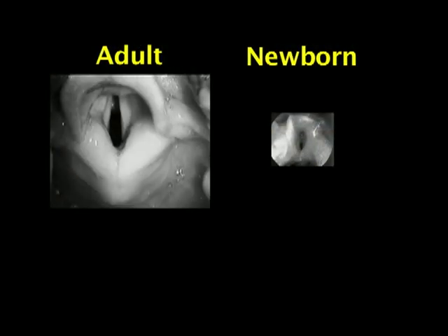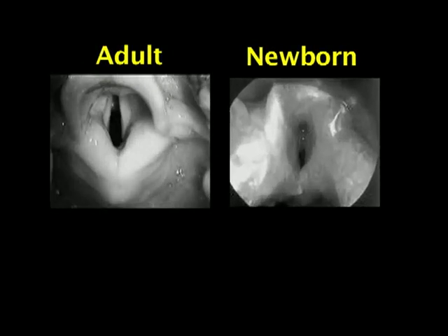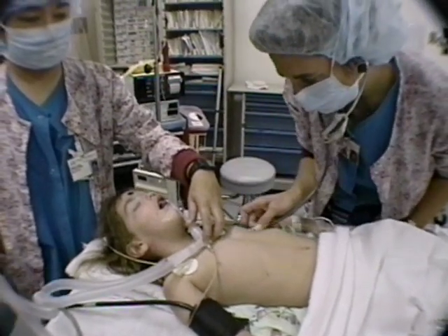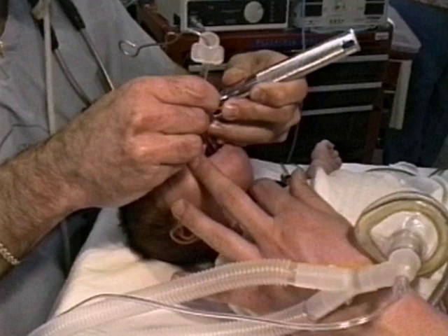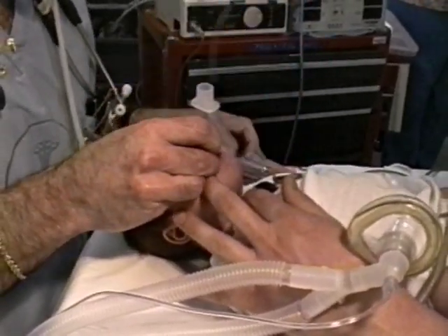Airway management and intubation in children are more challenging because their anatomy and their responses to stress are different than adults. Don't hesitate to ask for help or to allow a more experienced intubator to take over. Complications can occur even if perfect medical management is followed. Keeping these differences in mind will minimize the risks.